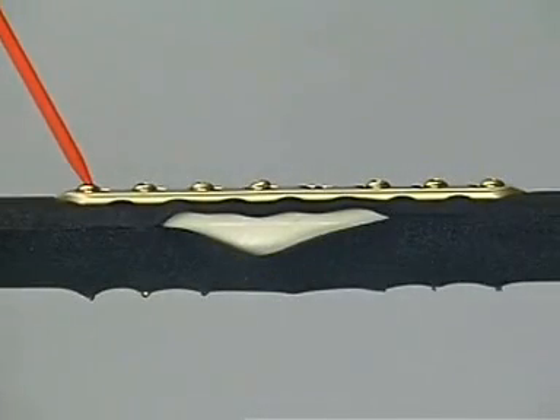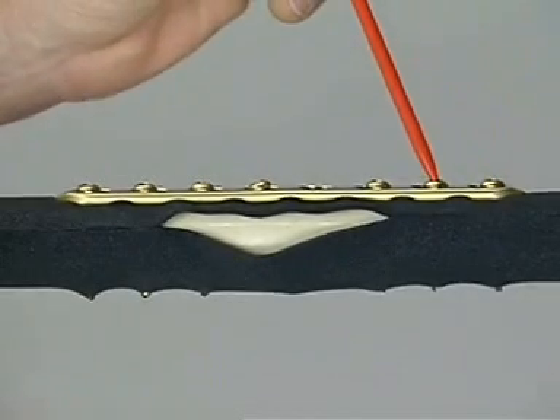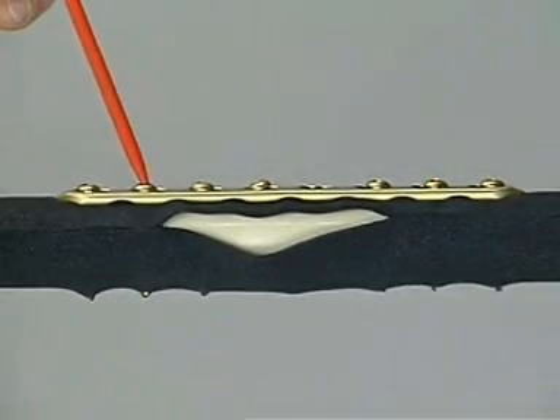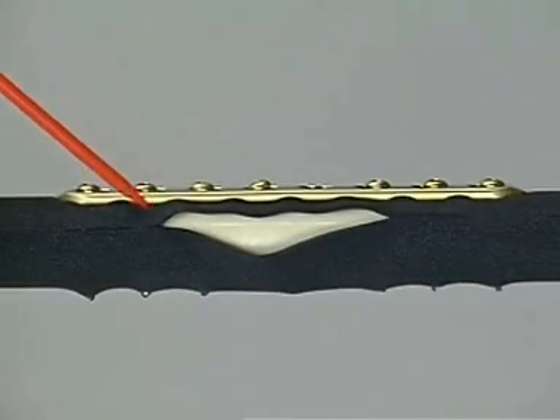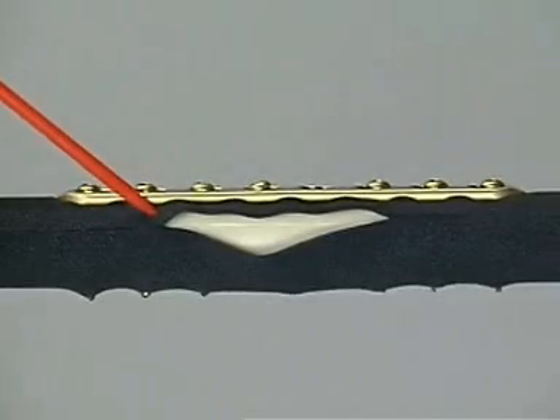The fixation is finished off with two more 4.5 mm screws at either end of the plate. However, the periosteum has been compressed as well, which interferes with the cortical blood supply.